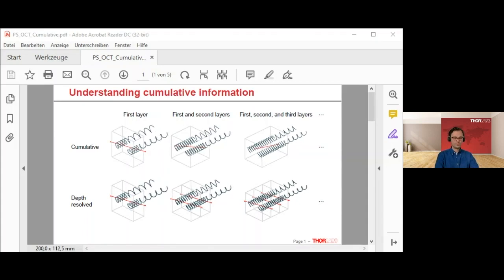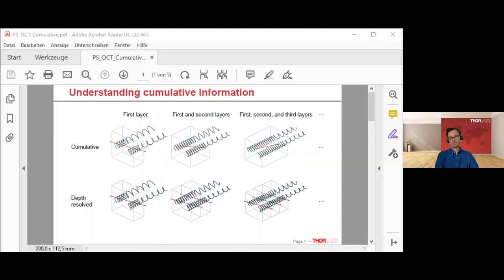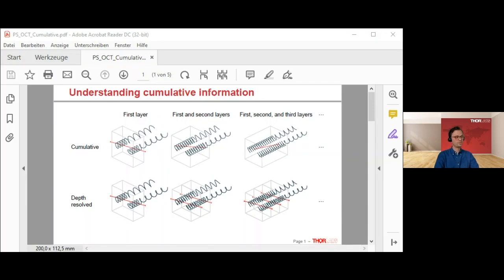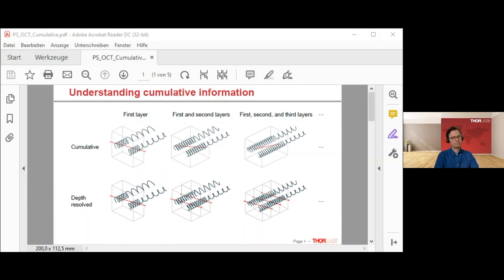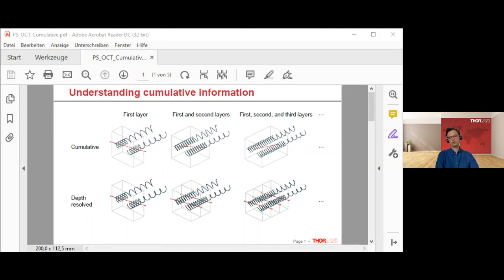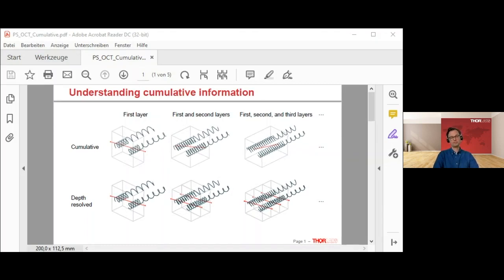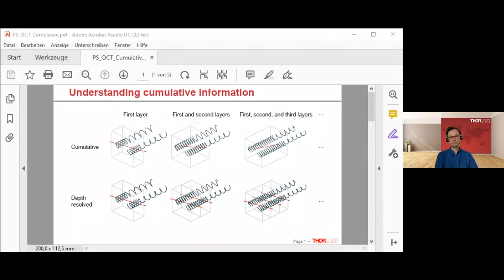And for OCT, we need to get some scattering inside of the sample to really make use of that. Of course, you can use much more calibrated quarter wave plates or other clear materials, and then look at the effect on the bottom interface or a mirror that's placed below. But that's only giving you a very sharp line.